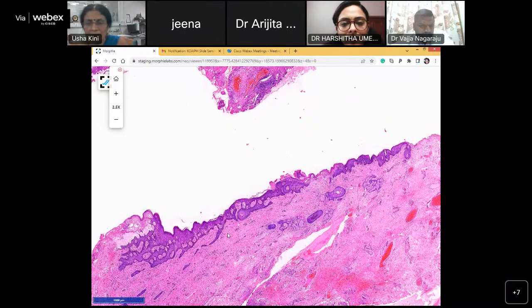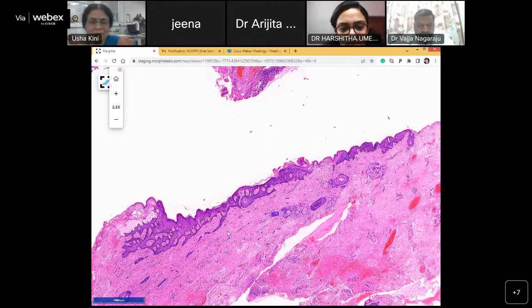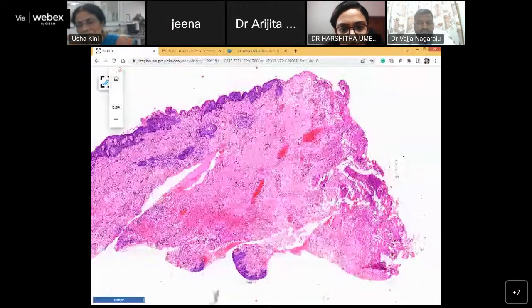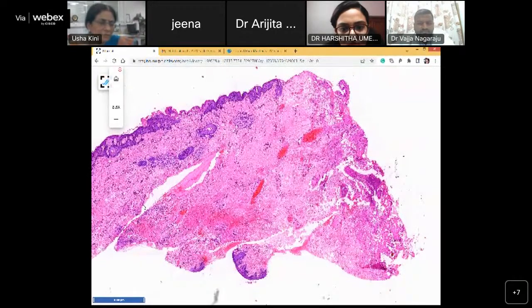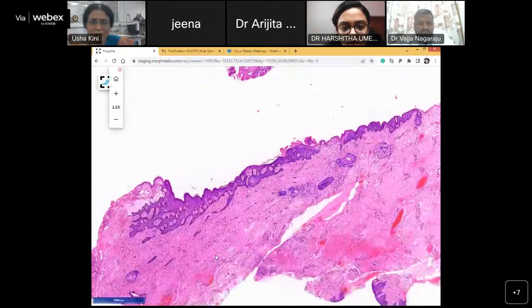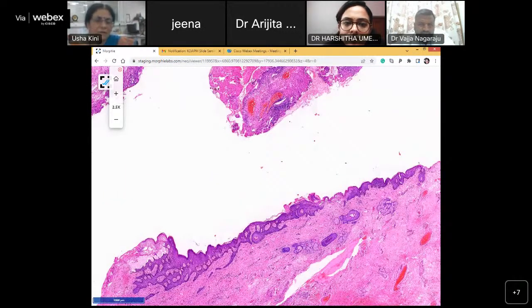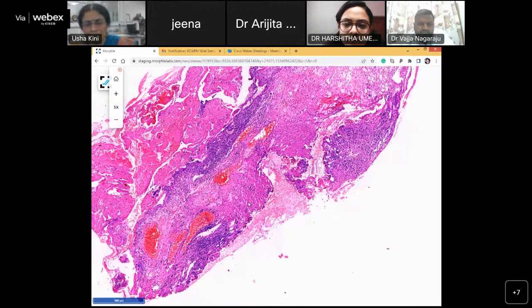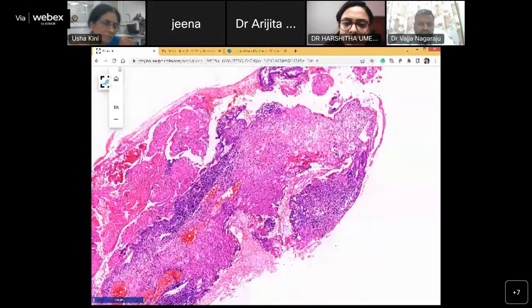If you look at this, there are whole lots of congested blood vessels, which is part of the surgery. But if you look, there is some cautery effect. I'm not very impressed by this fragment. I don't find anything good in this. Did you find any other epithelium other than the anal skin? No, ma'am.